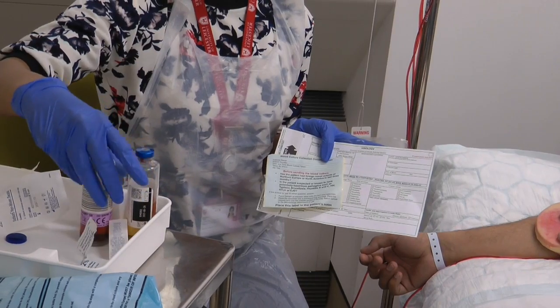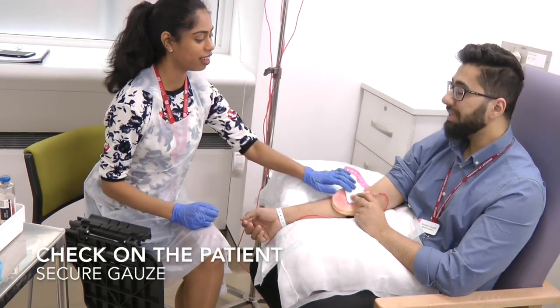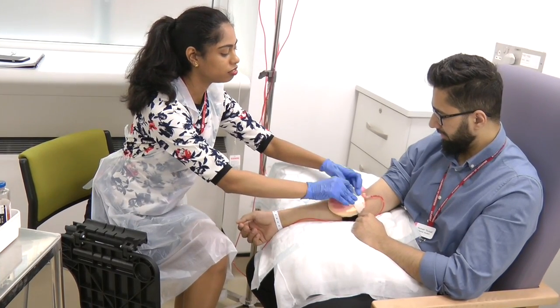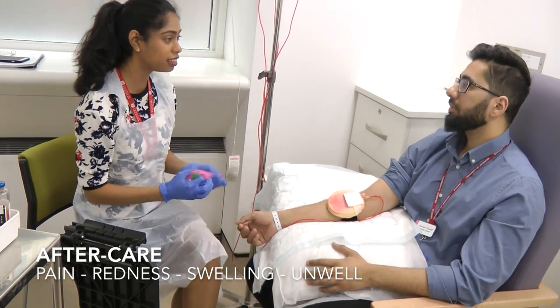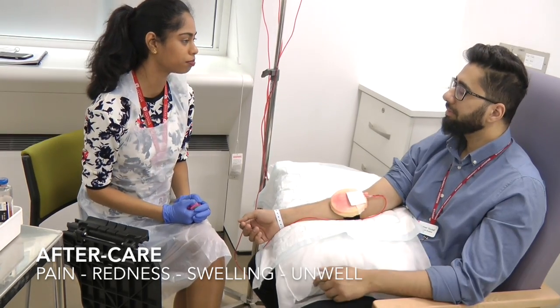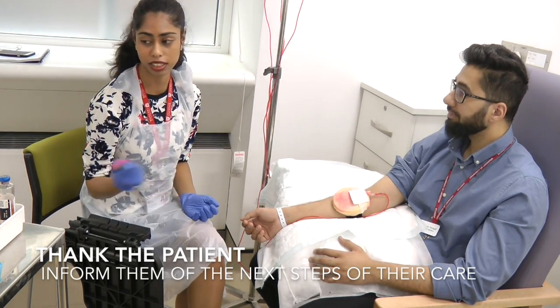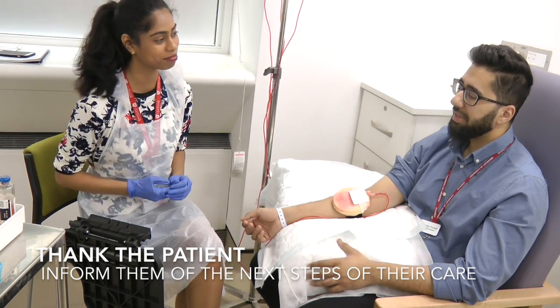So Neumann, how was that? That was okay. Can I just have a quick look at it before I tape it down? That looks fine. You can keep this on for about 20 minutes and then you can take it off. If there is any pain, any redness, swelling, or if you feel generally unwell or it's itchy, please do let one of the nurses know, or myself if I'm around. Thank you very much — we'll get back to you with the results when we get them.